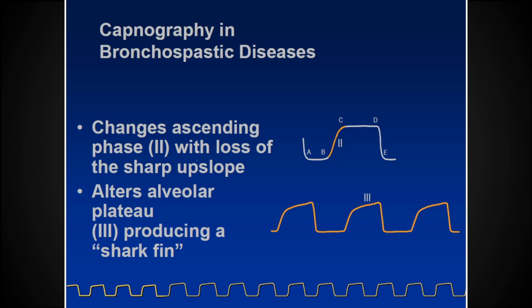Don't know? Okay. What would I think, Landon? Asthma is our go-to. I'm essentially associating this shape with bronchospasm. The question would be, can it be anything else? Yes, it can. What could it be? COPD? Be more specific? Bronchitis. There you are, my man.